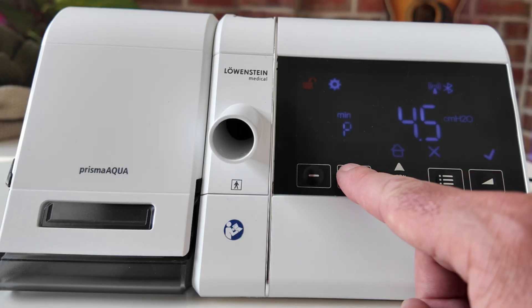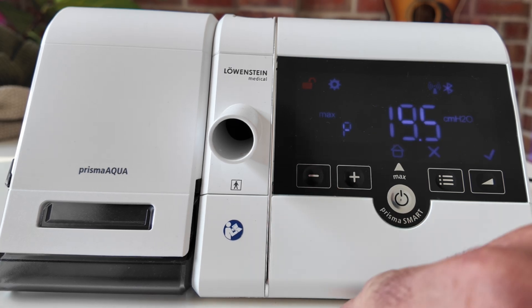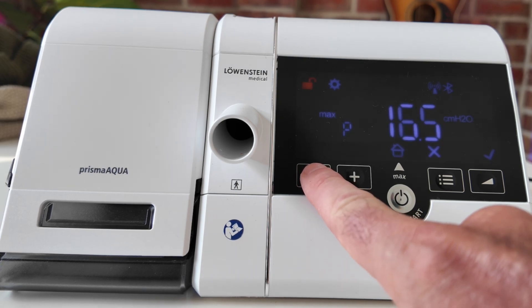So you might wanna increase your pressure minimum from four, which is the lowest, up a little bit — try five, 5.5, six — and see how you feel at the start of the night. And vice versa, if a patient's struggling with mask leaks or just therapy comfort, pressure's getting too strong, they're struggling to exhale, causing a lot of issues, then they might look at reducing the pressure maximum to make it more comfortable for the patient and improve compliance. So for this example, let's set the minimum pressure to six centimetres. Just press the plus button until you reach six, and then press the ramp button to lock in that value. Now we'll reduce the maximum pressure to 16 by pressing the minus button. Once you've got it set to 16, press the ramp button again to lock it in. Congratulations — you have successfully changed your CPAP therapy pressure levels, and that's a big step towards getting your CPAP therapy dialed in just right.